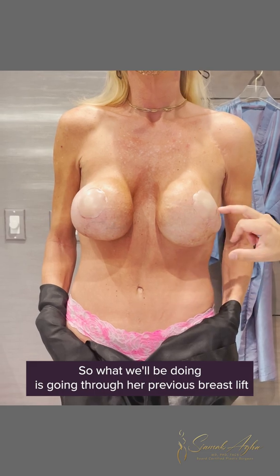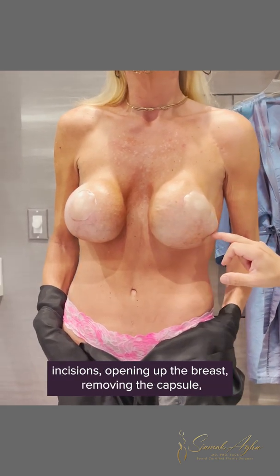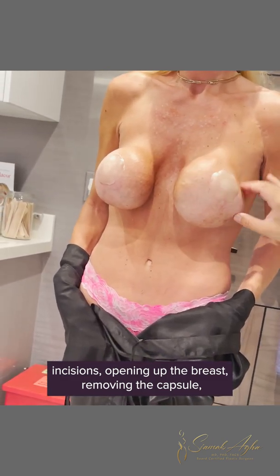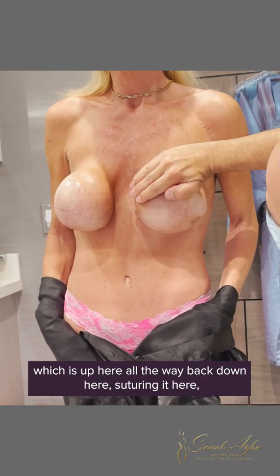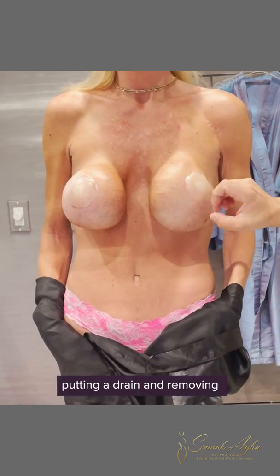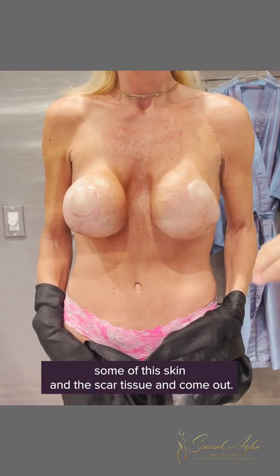What we'll be doing is going through her previous breast lift incisions, opening up the breasts, removing the capsule and the implant, bringing the pectoralis muscle — which is up here — all the way back down and suturing it here, putting in a drain, and removing some of the skin and scar tissue.